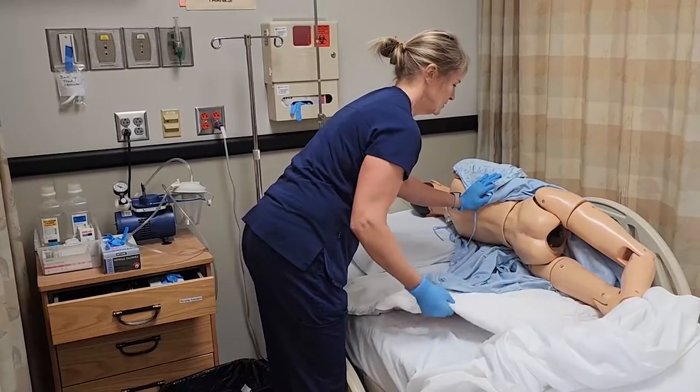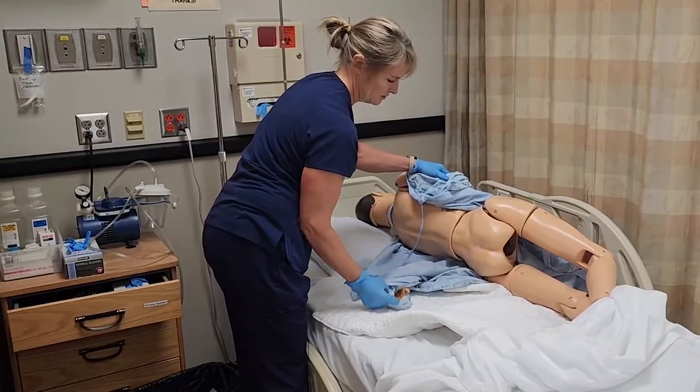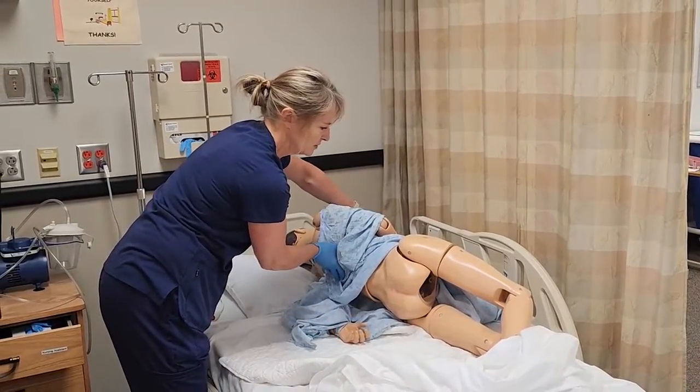In the Sims position, the left arm should be underneath the resident on the back side. The Sims position is rarely used — it's really only for rectal temperatures and administering enemas that a nurse would do.